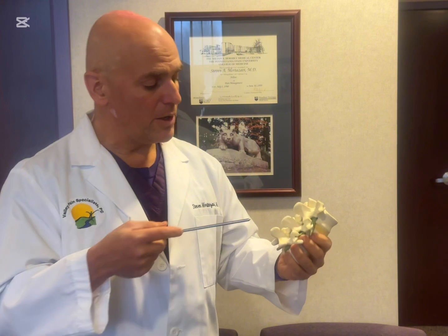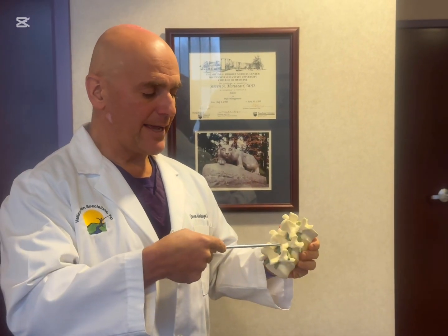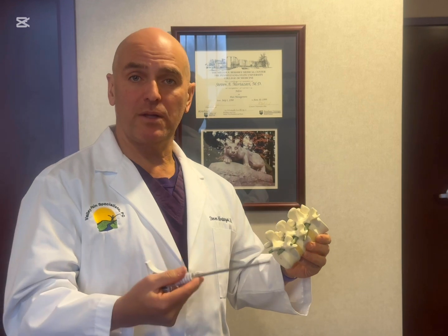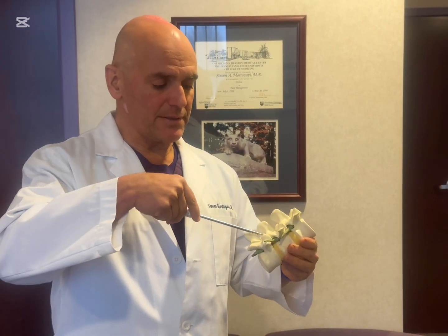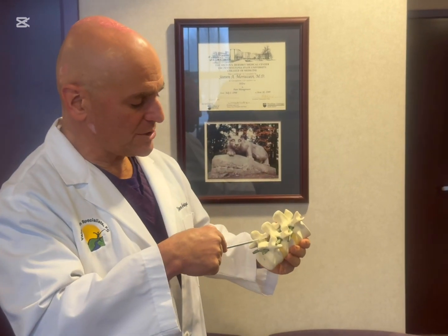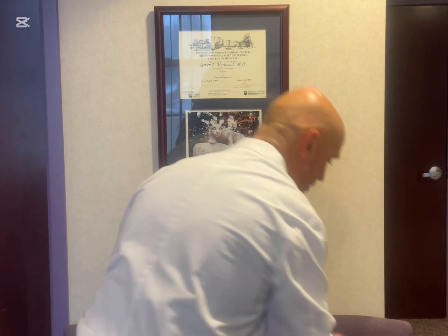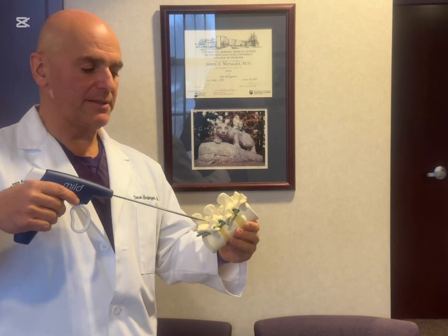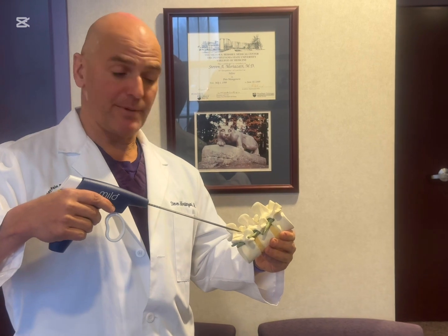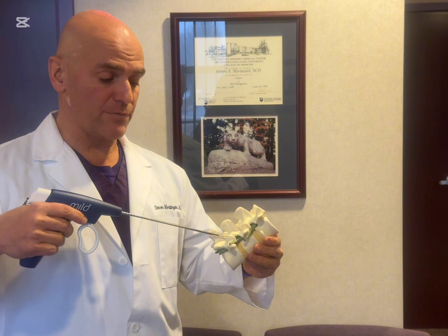With traditional injections like epidural injections that we perform here as well, we can place medicine in the spine next to these nerves and help alleviate some of the swelling and pain. However, with this procedure we're actually going to place instruments in the spine and remove sections of bone called lamina as well as sections of the ligamentum flavum, which is a big thick ligament in the spine that can cause narrowing and pressure on the nerve roots.